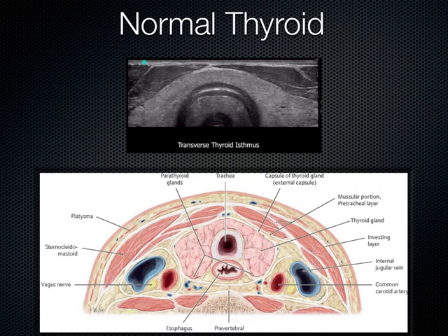And the anatomy couldn't be more obvious on ultrasound. It's right up next to the edge of the transducer, so we can use a nice high-frequency linear transducer here. This is all the thyroid here. This is the trachea. And we see the mirror image artifact of the thyroid isthmus. This is the isthmus of the thyroid. We see the mirror image on the other side of the trachea right here. So that's just the mirror image of the isthmus down here, not actually in the trachea, but that's how it looks because of the physics of the situation.